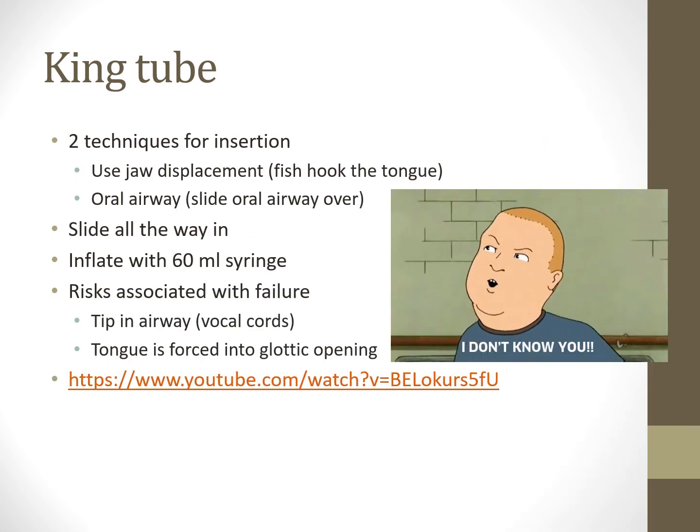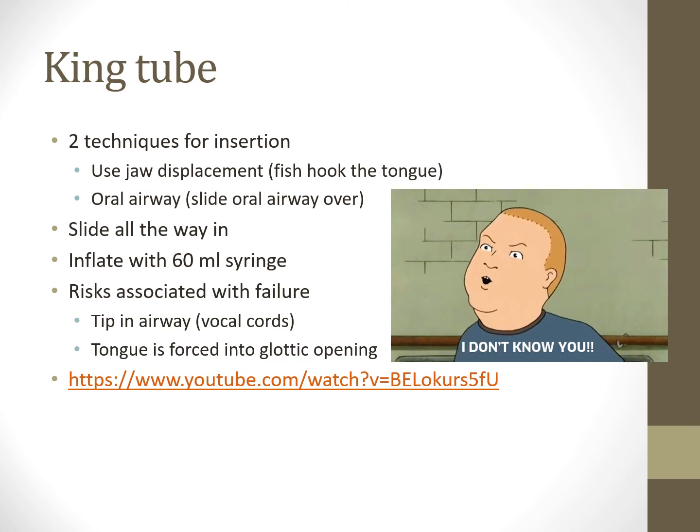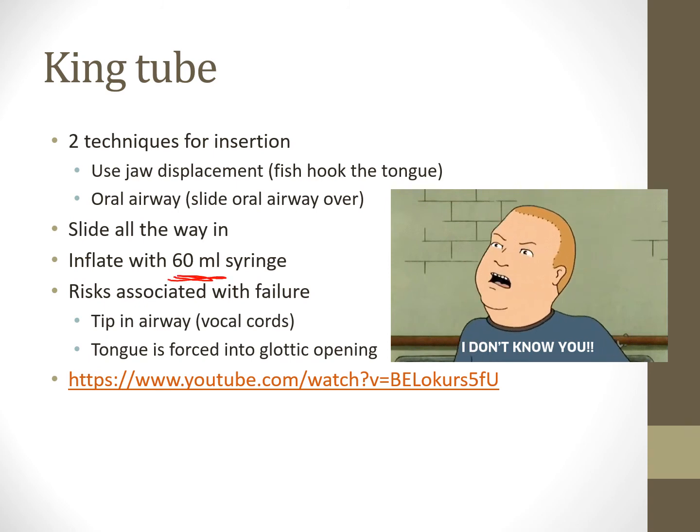Right? Two insertion techniques for this: the jaw displacement, where you fishhook the tongue, or the oral airway, right? Slide the oral airway over, and then you can sort of see it. Make sure it goes all the way in. Use a large volume syringe. You can't use your 10 ml syringe here.